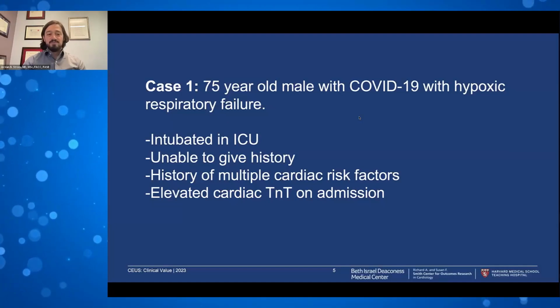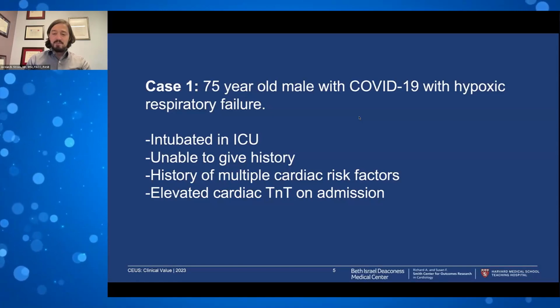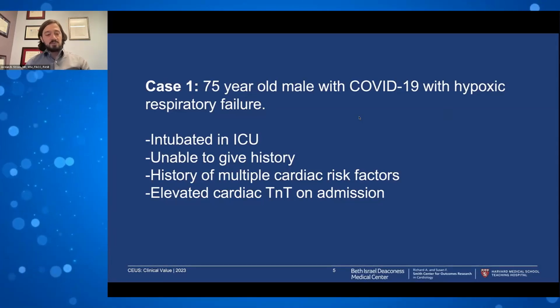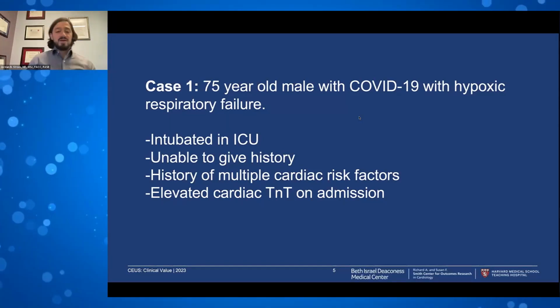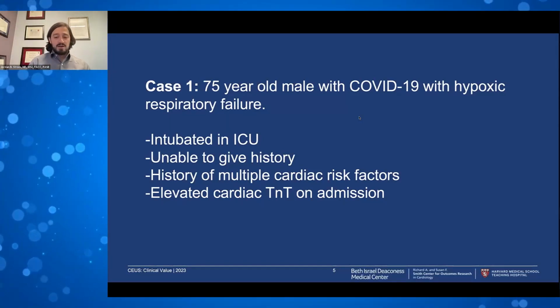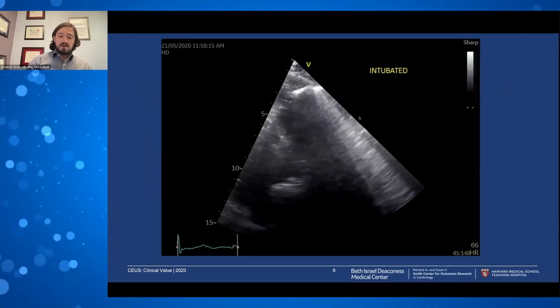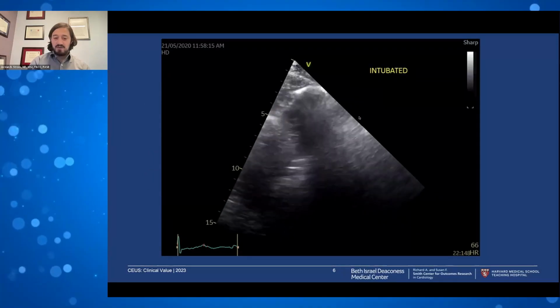One of the questions is whether the elevated cardiac troponin is simply due to demand from their underlying hypoxic respiratory failure, or whether there is an acute coronary event or some coronary history of MI that could potentially explain this finding. And here, this is a very common image to get amongst those of our patients.